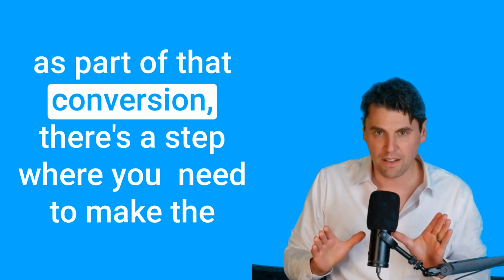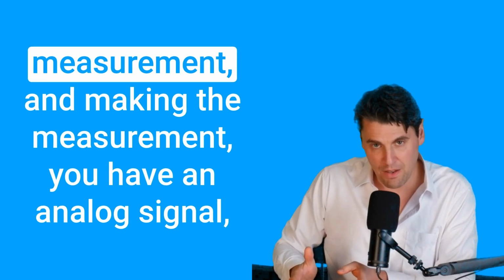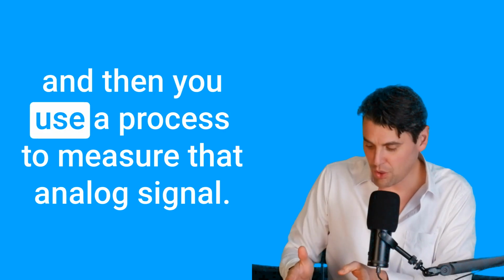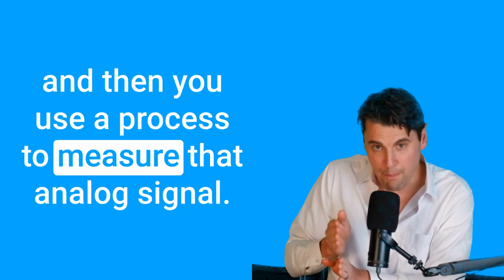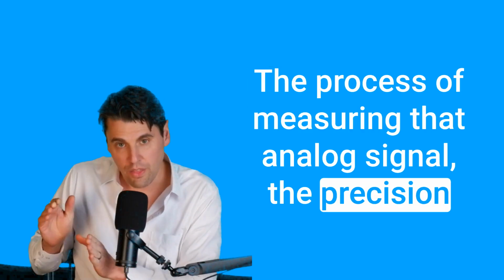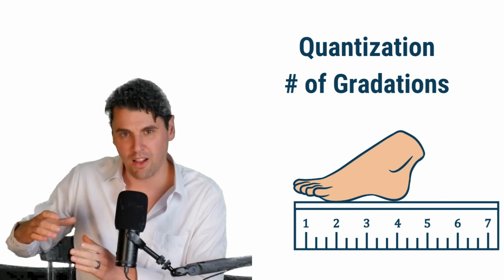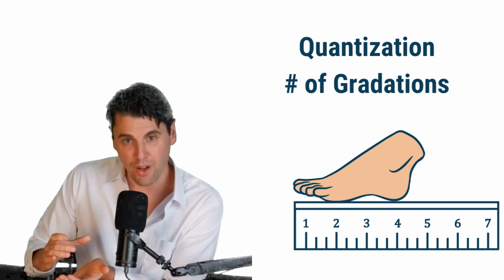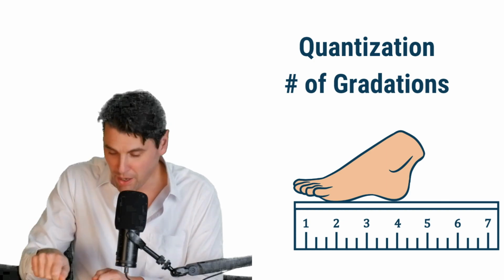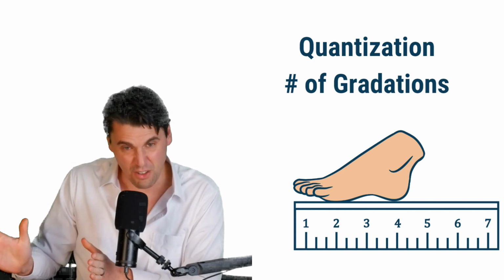As part of that conversion, there's a step where you need to make the measurement. You have an analog signal, and then you use a process to measure that analog signal. In the process of measuring that analog signal, the precision has to do with how many gradations you have. So if the analog signal is how big is your foot, and we measure that, we're going to look at a ruler, write a number down, and that's going to be a number that we can convert essentially to a digital number.